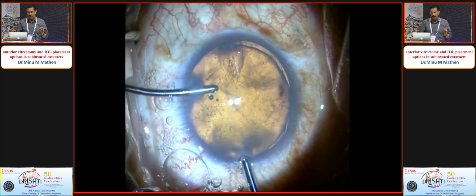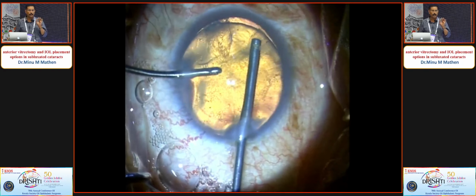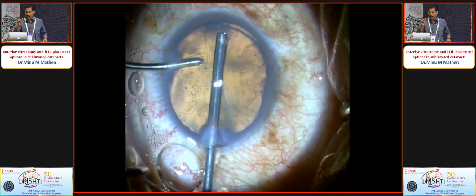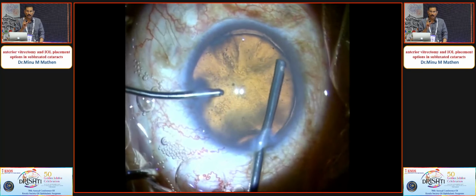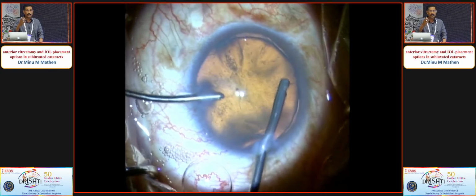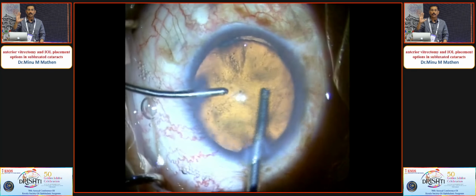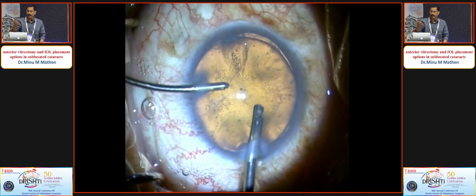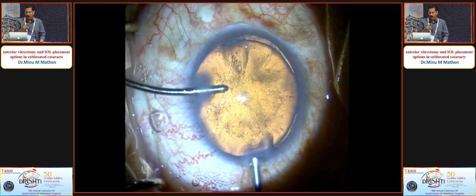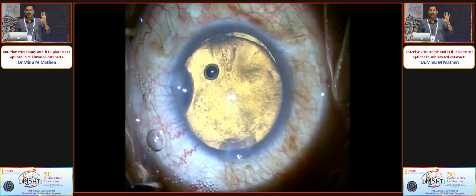So here in the beginning itself there is vitrectomy. So irrigation and vitrectomy. Through the main incision there will be a leak, so it's better to do a vitrectomy through perfect fit side ports, and adequate vitrectomy to clear the anterior chamber alone. Don't keep pulling vitreous from wherever there is a dialysis. Don't go into the dialysis area and keep on doing it, you will lose vitreous support. It is very, very important to have vitreous support for these kind of subluxated lenses to be held there during surgery. Once it is done, as madam was showing, the viscoelastic which is injected is very, very crucial.